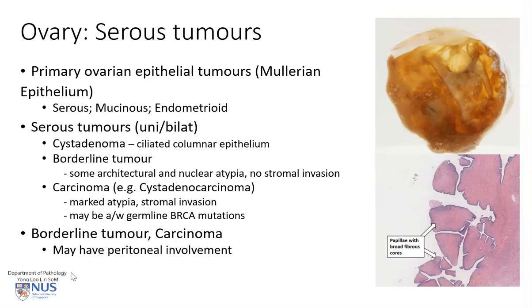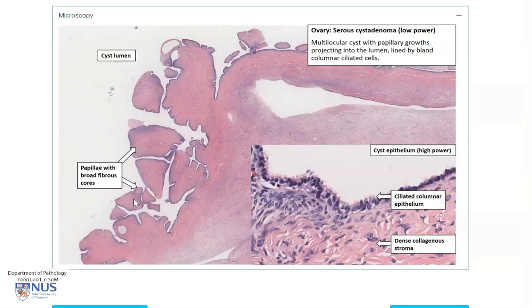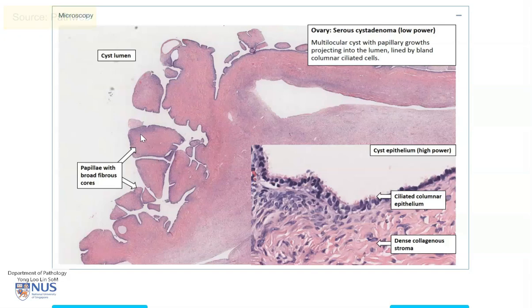Let's take a look at the microscopic features of a serous cyst adenoma. These pictures are taken from the online pathology resource Pathweb. We can see these papillary projections are composed of a fibrous core and are lined by a single layer of epithelium. These are columnar cells, and you can actually just make out the cilia. So we have a unilayered ciliated columnar epithelium, and there is no significant architectural complexity or atypia, and the nuclei are very bland.